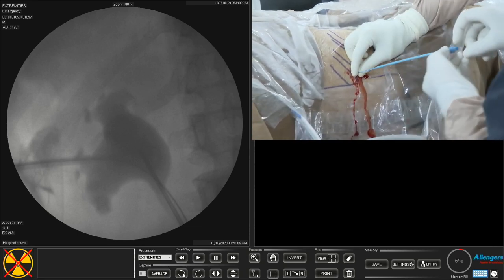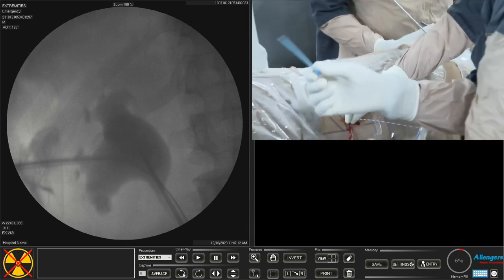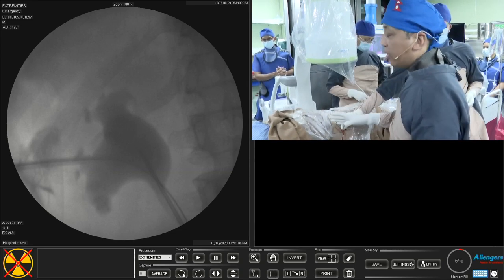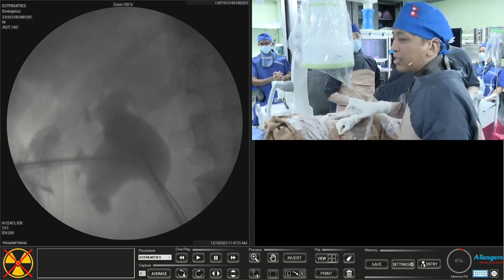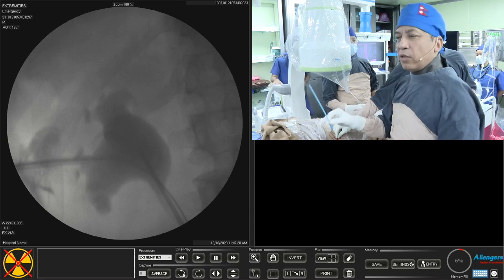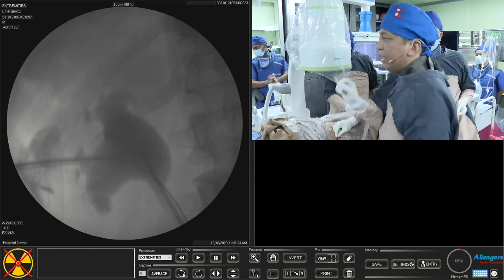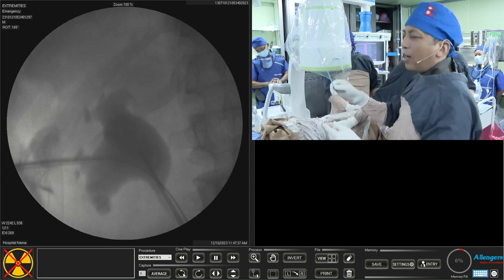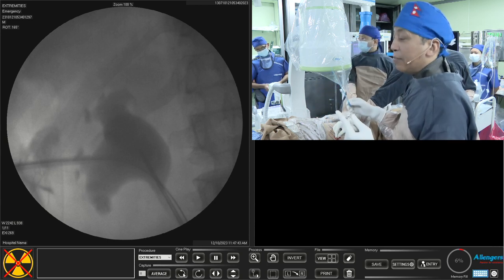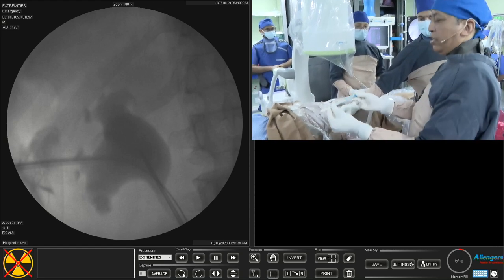My second step is dilation with the 20 French. I do two-step dilation — this is very important. Many people do one-step dilation with forceful advancement, but if you do two-step dilation starting with 10 or 12 French first, it makes subsequent dilation very easy. It hardly takes 30 seconds to complete dilation, so I am not in a hurry to do single-step dilation just to save time.